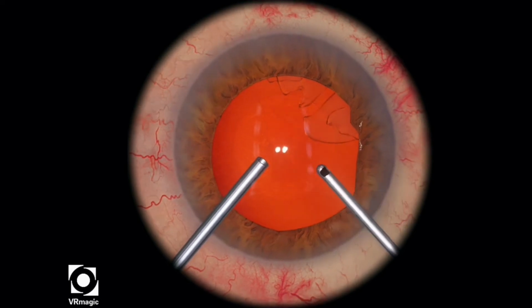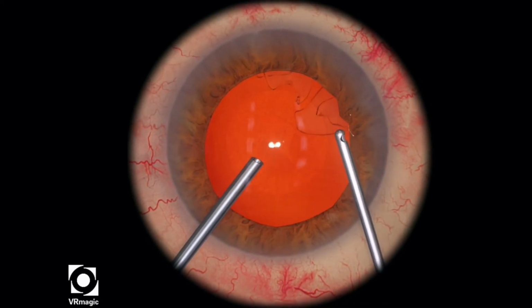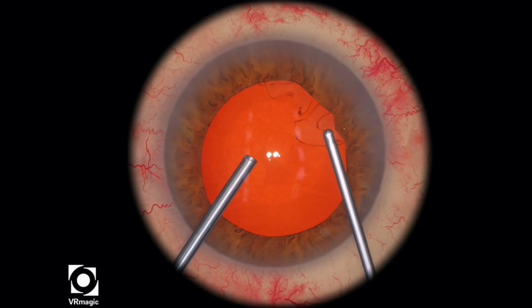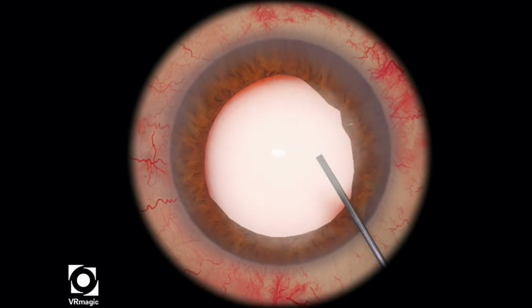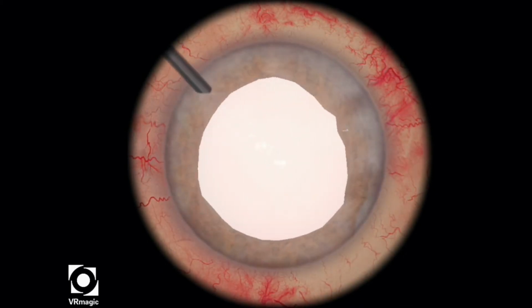especially near structures like the anterior capsule and also the iris. So I turned the aspiration all the way up to 500, and then the vitrectomy cut rate almost to about 2000, so almost to the maximal settings. And I found some success that way. It's still very difficult, as you can tell. My hand is in very awkward positions when I'm chasing after the vitreous.